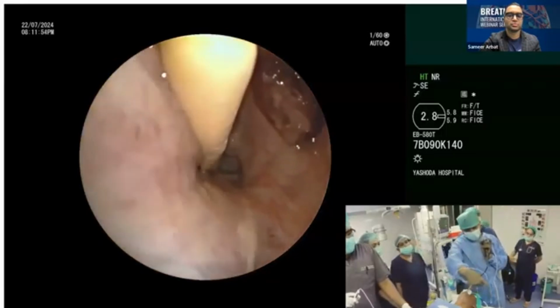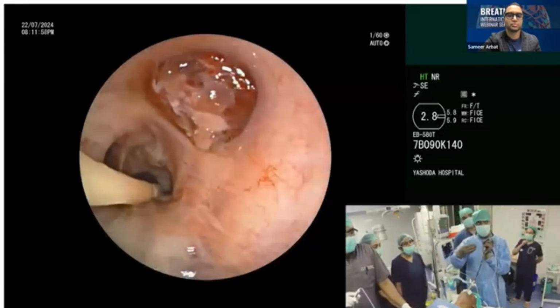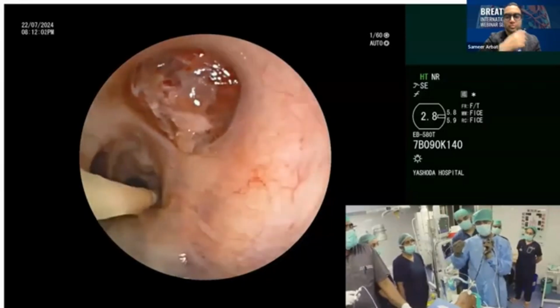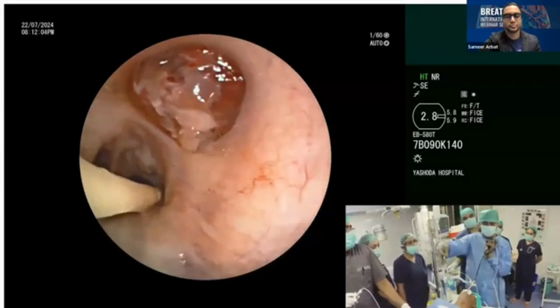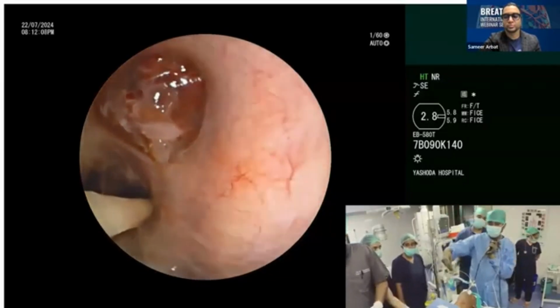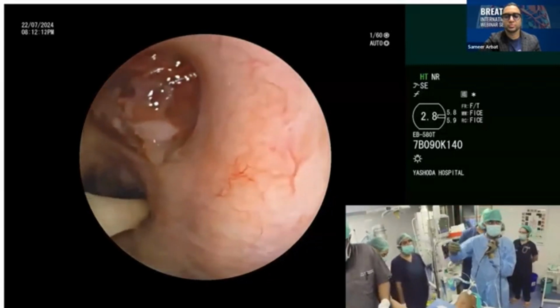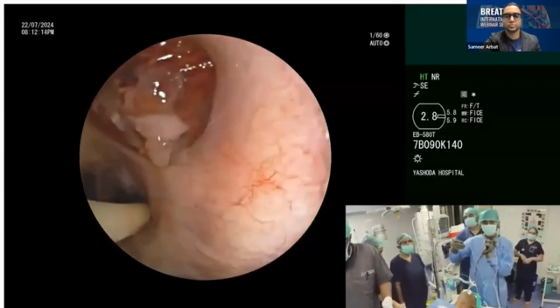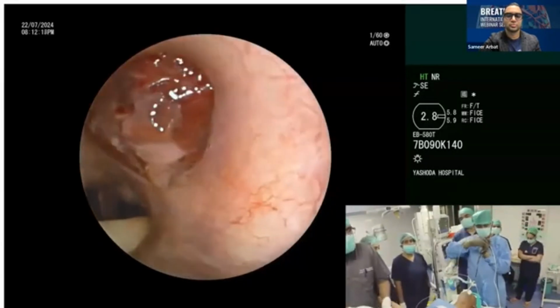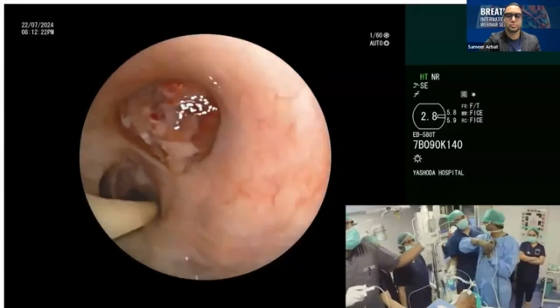So I make sure that I give proper instructions and I set the watts in the electrosurgical unit around 20 to 25. Once I am very sure that the anesthetist has kept the FiO2 less than 0.4, the settings are perfectly made and my snare is checked, I will go for electrosurgical snaring of the tumor. So now you can see that I am holding the electrosurgical snare in my hand, and I am passing it through the working channel of a flexible bronchoscope.